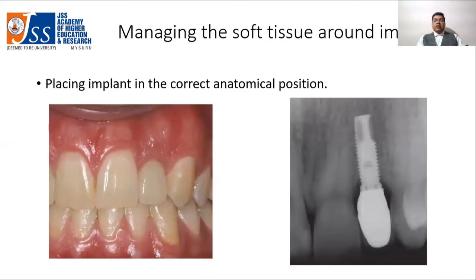Based on our understanding of constancy of gingival tissue thickness overlying alveolar bone surrounding teeth or dental implants, and our knowledge of healing behavior of peri-implant soft tissue around the surgical wound, it is possible to estimate the final position of healed tissue around restorations placed on dental implants.